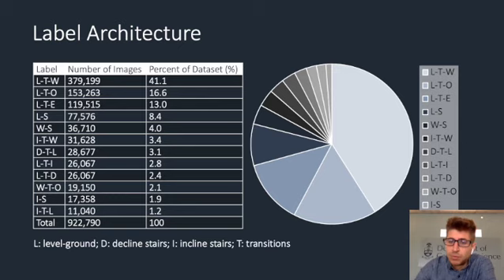Here's an overall breakdown of the environment classes in the ExoNet dataset. And one thing I want to highlight with this slide is that the class distributions are not evenly balanced, as visually shown in the pie graph, which is an issue in machine learning. However, these imbalances are representative of the real world and the frequency at which we interact with each of these environments. So presumably, such imbalances should be somehow represented in your classification system.